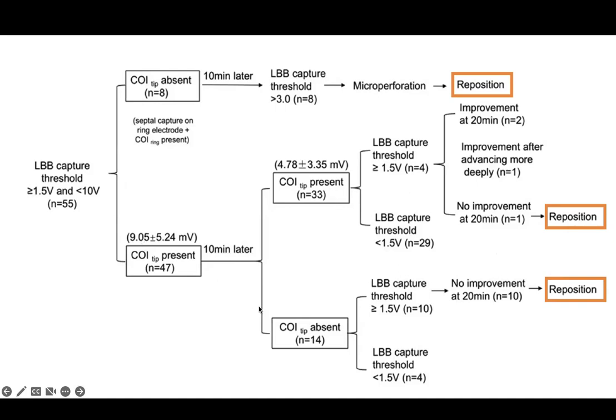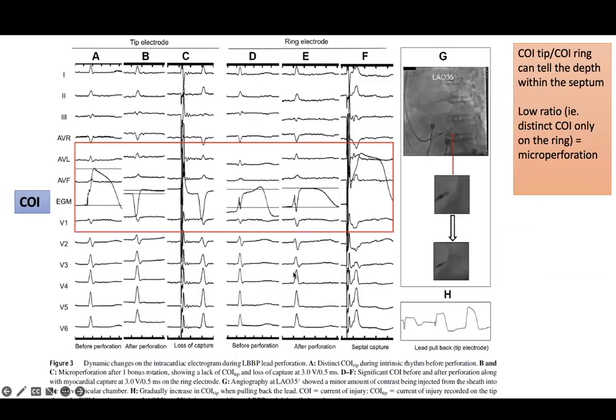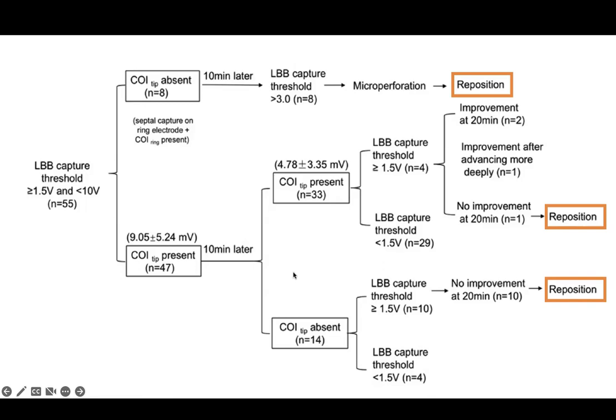And if you wait 10 minutes and you don't have any current of injury, then you should reposition the lead, because most of the time that is the case where the capture threshold remains high. Jackie, yeah, go for it. Can I ask a question?